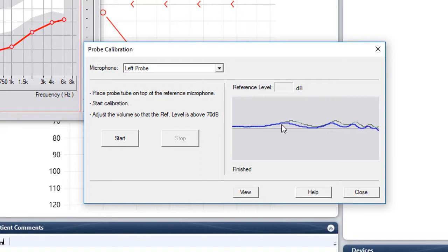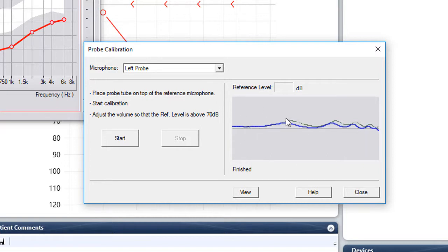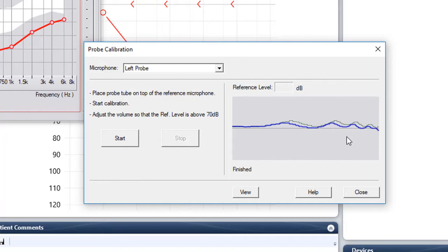This is what you're looking for. It's going to be a wavy blue line just like this that sits on top of the gray reference line here. If there's any really sharp peaks or valleys across the entire line, the probe tube has come away from the probe mic or there's a hole in the probe tube. So just double check that and re-run it.